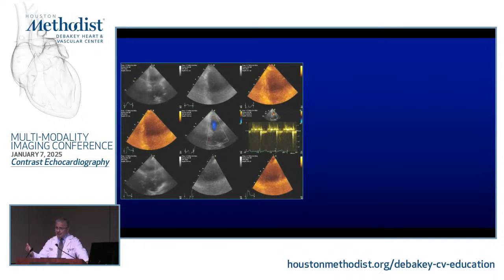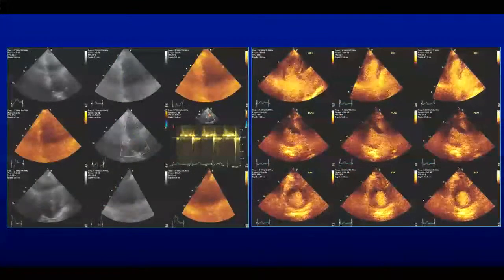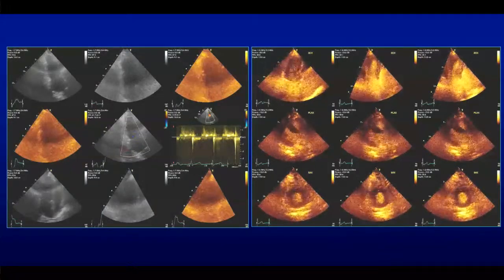So the bottom line to you is, wherever you go, the impetus to use contrast is because of better quality of the studies that you're trying to do, more diagnostic accuracy, more impact on utilization, on management, on outcomes of patients. It's hard to measure, but people have done that already in the past, okay? So, yes, in a good laboratory, you would use contrast, and I think the sonographer has made the right decision, not a difficult one here, and then you could see that indeed the ventricle is really very good. So you go from a completely uninterpretable study to an interpretable study.